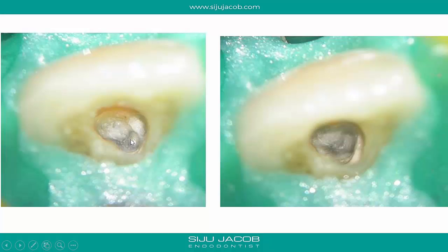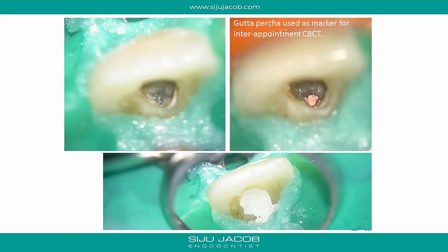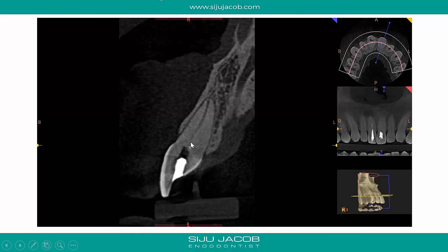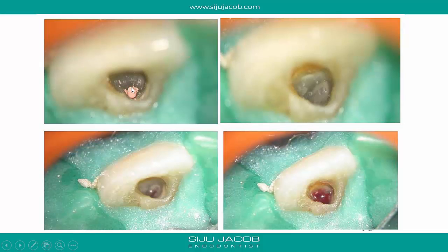What I did in this case was place a blob of gutta-percha where I was looking for the canal and then took an inter-appointment CBCT. I used gutta-percha as a marker — placed a blob from the obturator gun and took a CBCT. What the CBCT told me was that the actual canal is labial to where I was looking. This is where I was digging with the handpiece, and the actual canal was labial to that. Once I had that information, it was easy to look for the canal in the correct location rather than where I had been searching. I removed the GP and looked for the canal there.